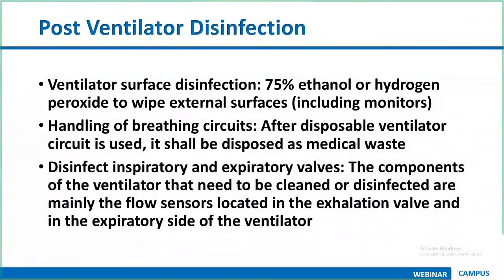70% methylated spirit you can use. Whatever solution your hospital infection control policy specifies for cleaning equipment or surfaces, the same can be used for cleaning the ventilator surfaces. Okay. The breathing circuit, etc., you have to dispose of as medical waste.